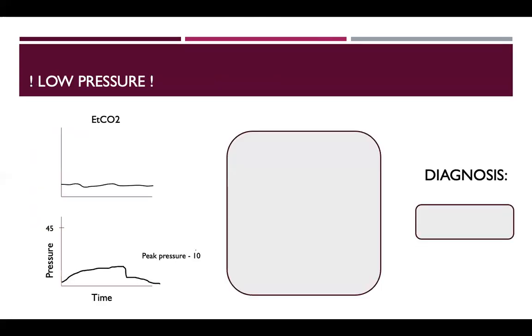So going to once again ask for participation. Let's say you walk into the room and the ventilator is giving you an alert of low pressure. And again, very simplified, these are the two graphs that I want you to look at, and I'll reveal more information as we go forward. So Ashna, what do these graphs look like to you? Are they normal? Are they messed up?